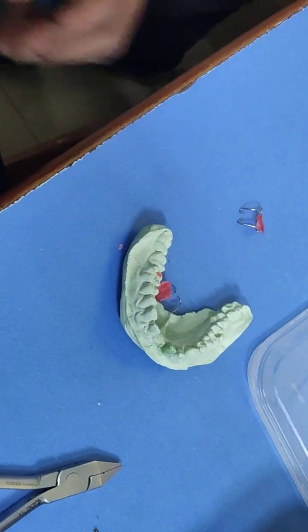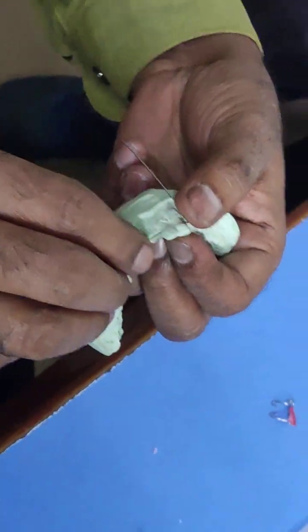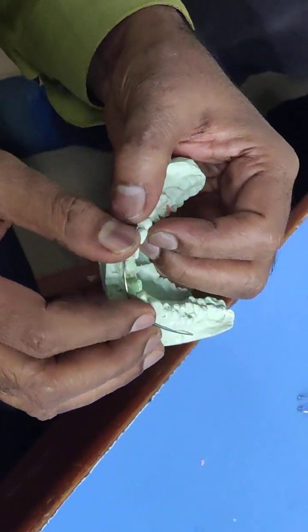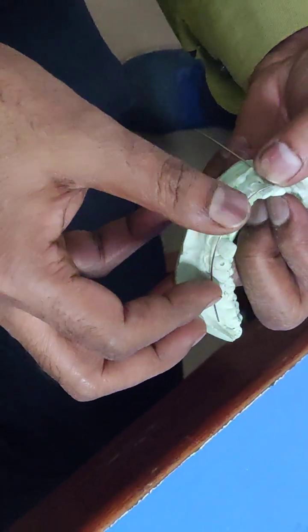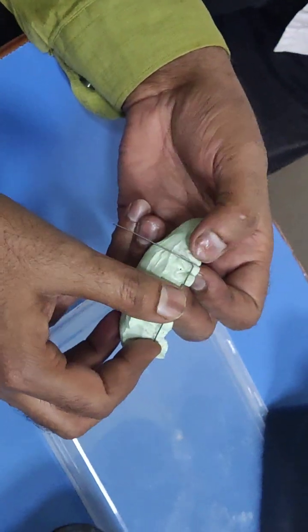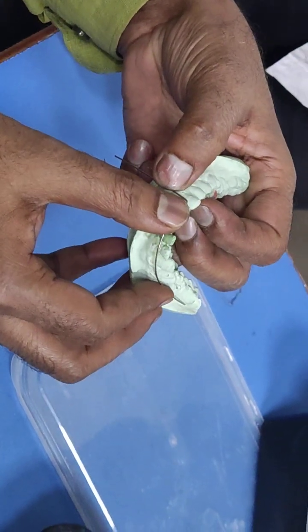By placing it in the middle third region, we can decide the height of the U-loop. So here I am placing it, and the U-loop will be from here.